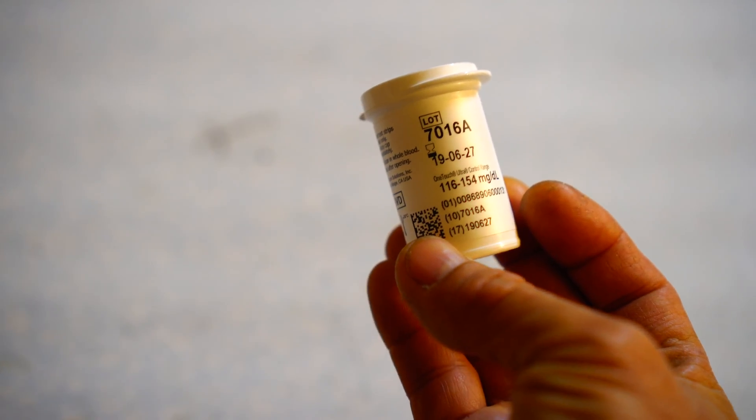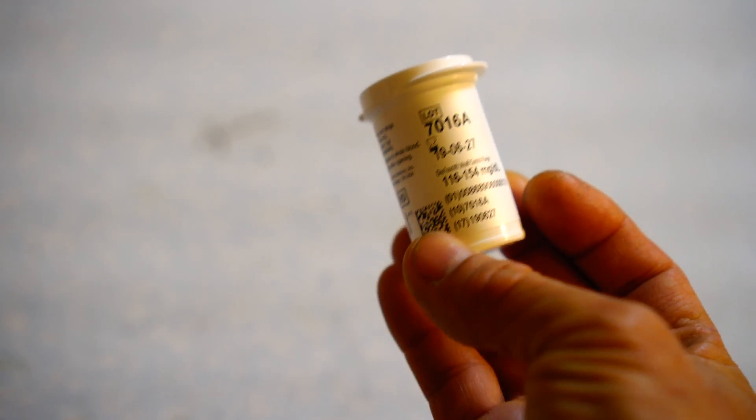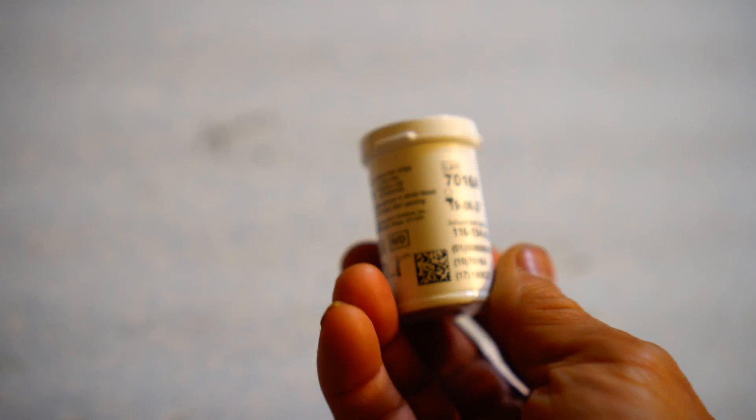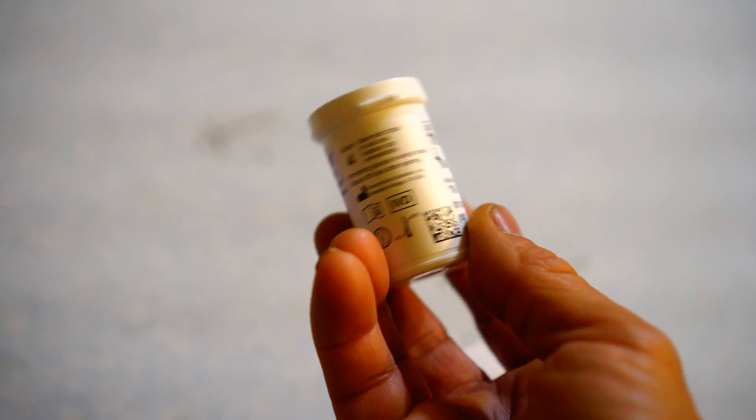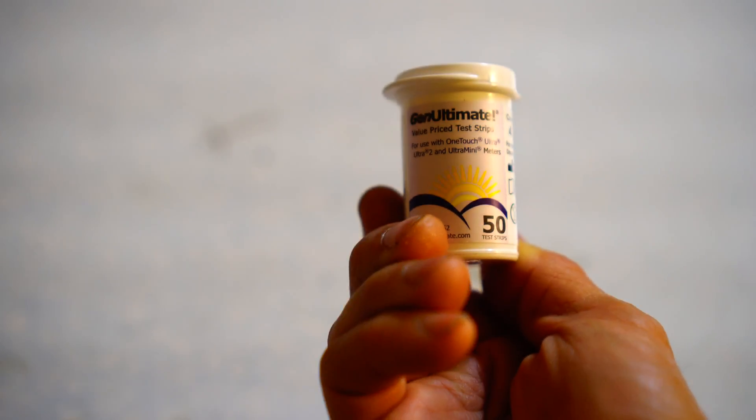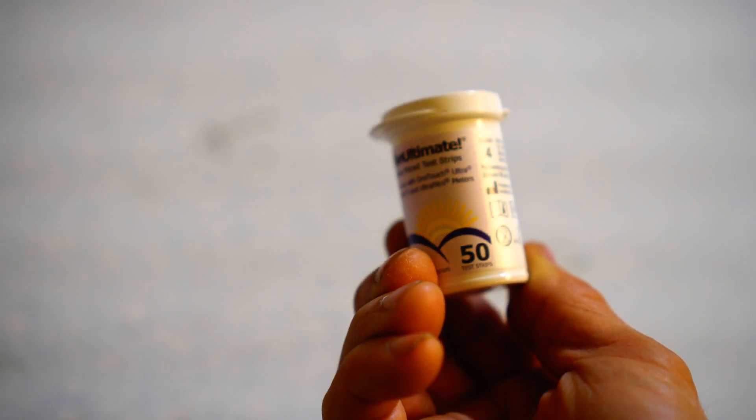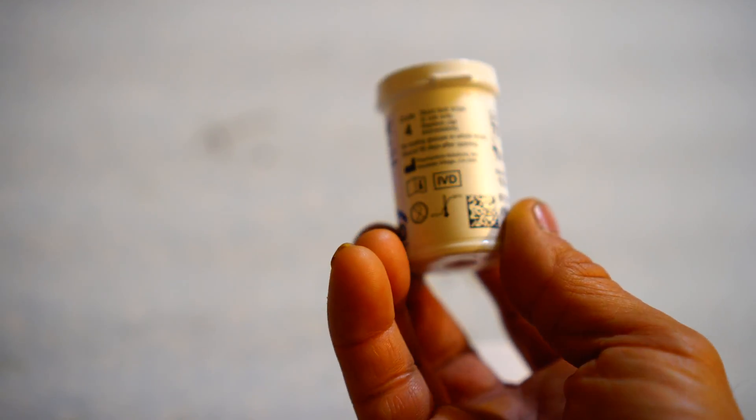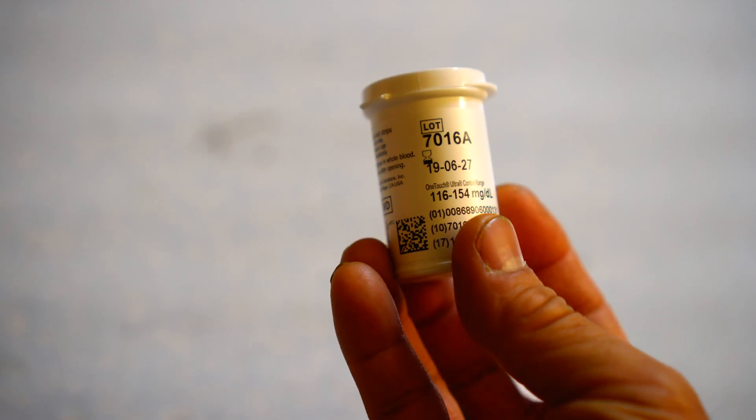I have two bottles of that, and the reason I'm doing this test is because I'm starting to get really strange results with these Gen Ultimate strips. Maybe the quality control has gone down.